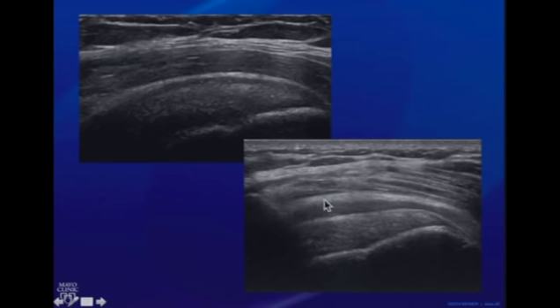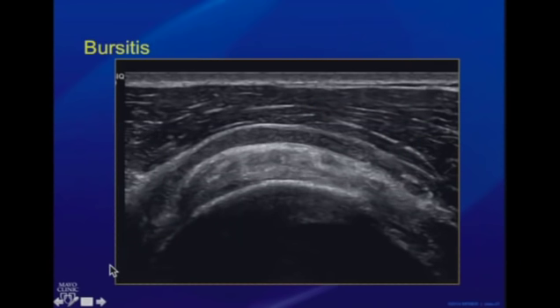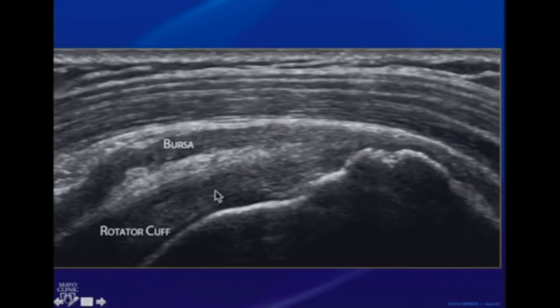Here's significant chronic bursitis. You can see the tendon is way down there and fairly normal thickness, although it might be slightly heterogeneous, but the subdeltoid bursa is really thick. Here's another example of chronic bursitis. You can see that's the deltoid, and this is the rotator cuff, and we can see significant thickening of the subdeltoid bursal space. Depending on how much fat is present within the bursa, sometimes it can have a really varied appearance. This bursa has these hyperechoic areas, and all that is just inflamed fat apart from some debris within the bursa.